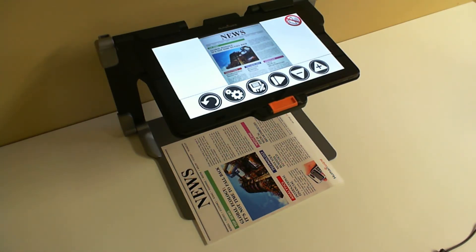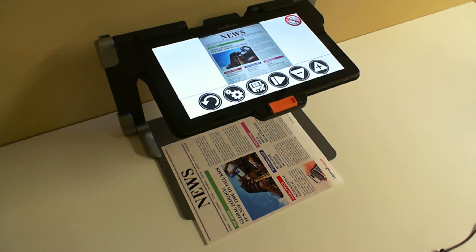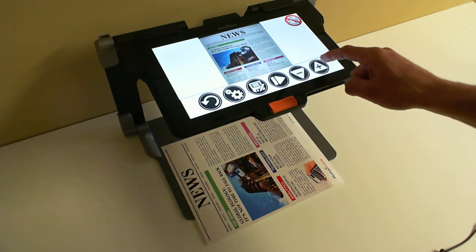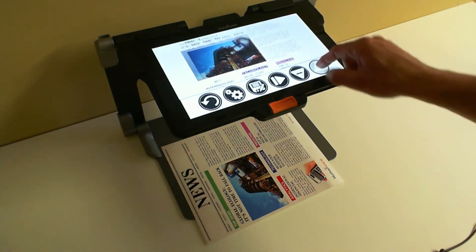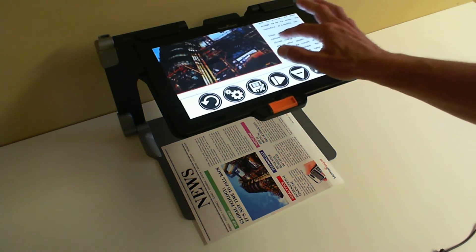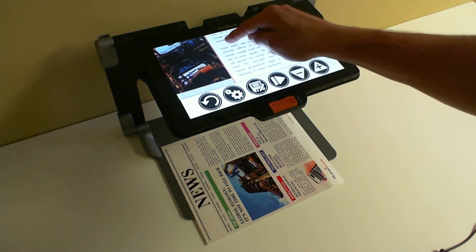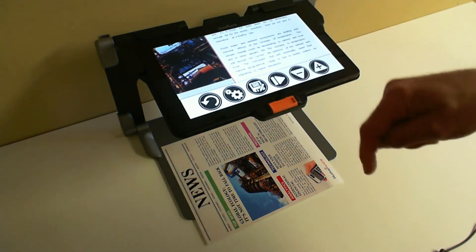Now when the OCR, or the character recognition process, is finished you'll be ready to start reading. You can start reading from the top left corner of the document by clicking on the play button in the button banner. But if I want to start anywhere else in the document, I can zoom in wherever I want and then press and hold on the word that I want to start reading.